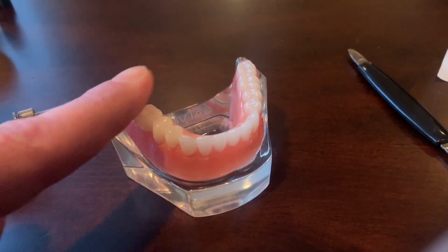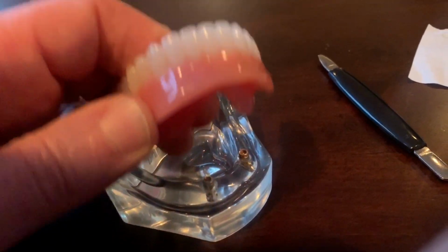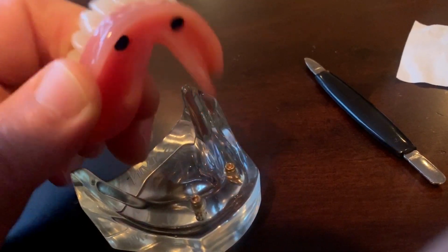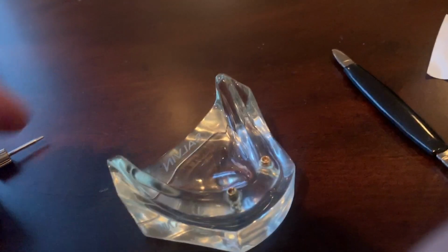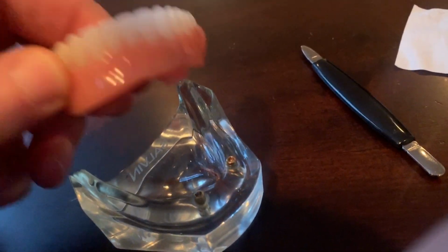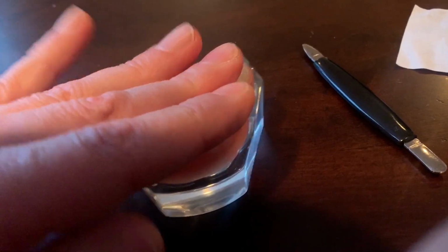One thing that you may notice is that these, well, I'll tell you, maybe you can't notice in this video, but these teeth are made of acrylic, which is a plastic. It's also thicker. You'll also notice that there's a lot of pink, and sometimes people are like, well, geez, do I really have to have all that pink stuff?